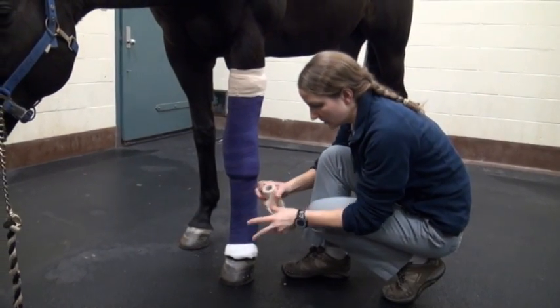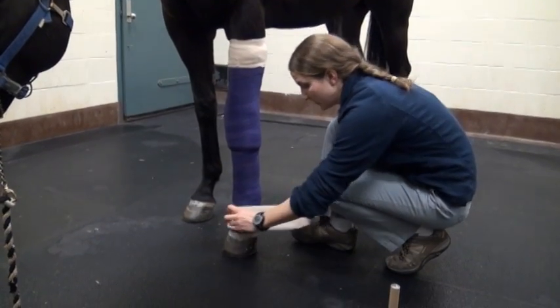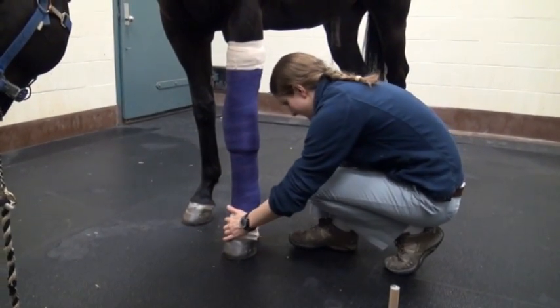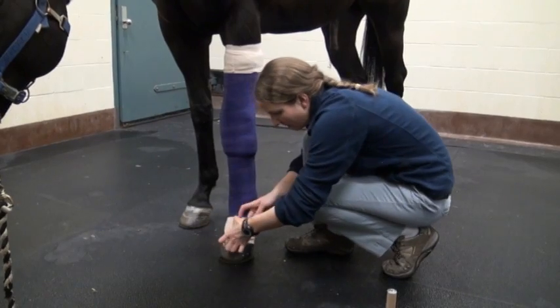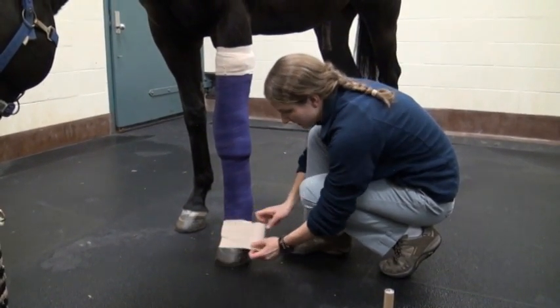And the elasticon just helps to prevent dirt or debris from getting into your bandage and helps keep bandages from sliding up or down. Again, apply about 50% of the elasticon to their foot or to their skin and 50% to the bandage.